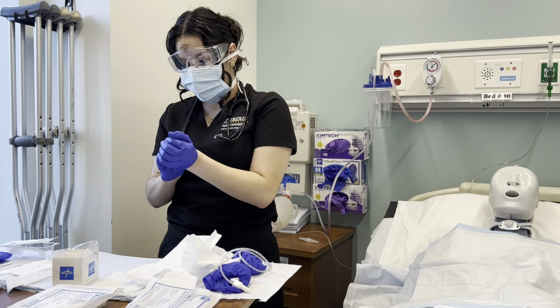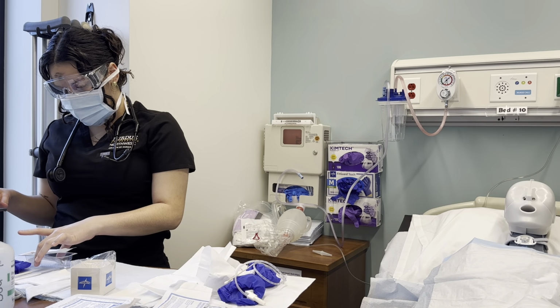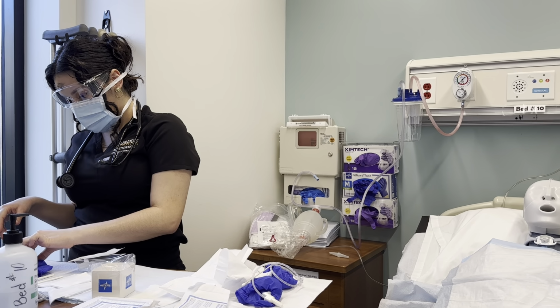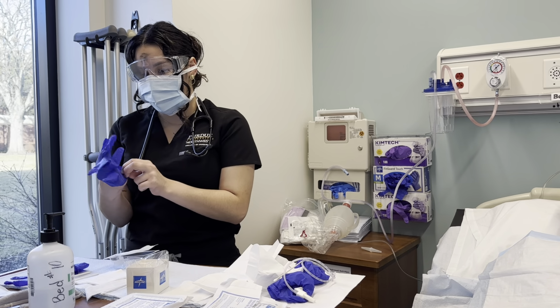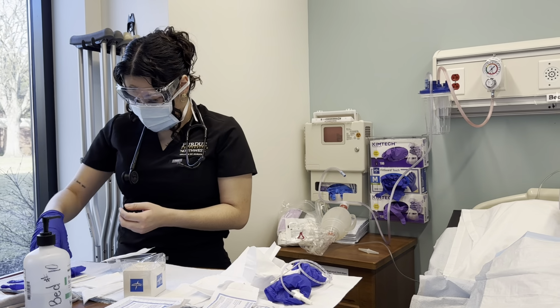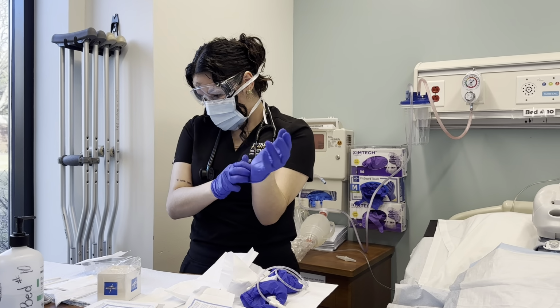Wonderful. Dispose of that. Dispose of the gloves. I will put on my sterile gloves. I don't have sterile gloves in this kit for the purpose of the video, so I'm using these as my sterile gloves. And unfortunately, safety again, is there anything you may be allergic to? Perhaps latex or iodine, which is what I would be.